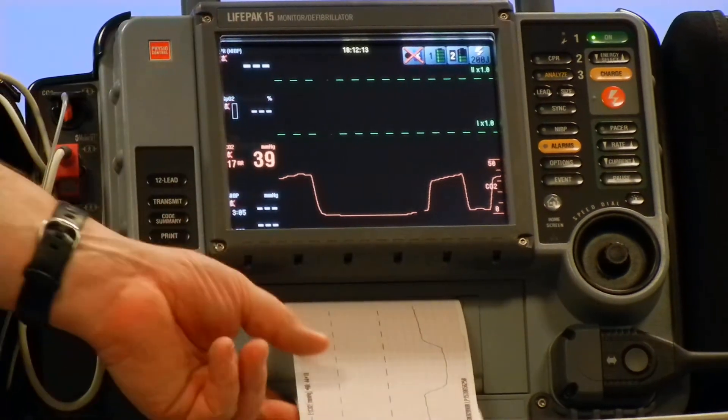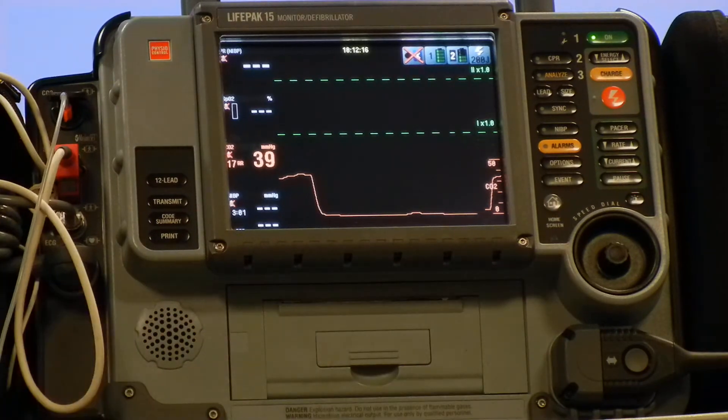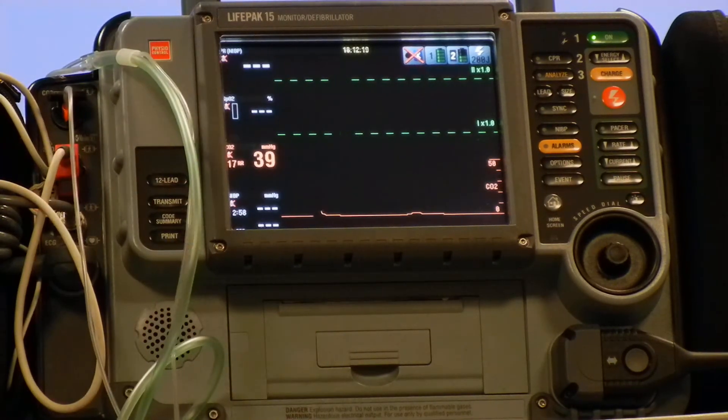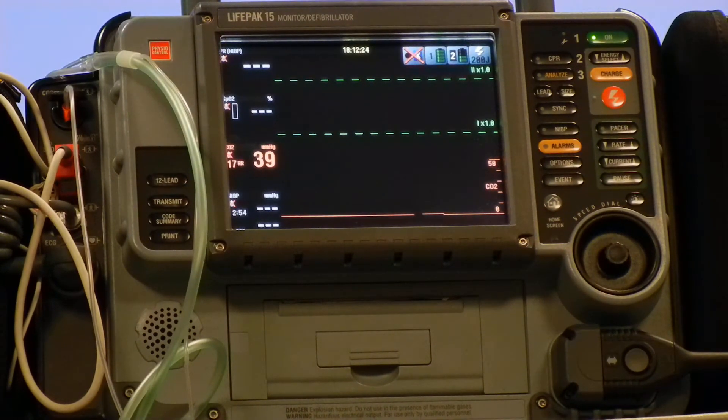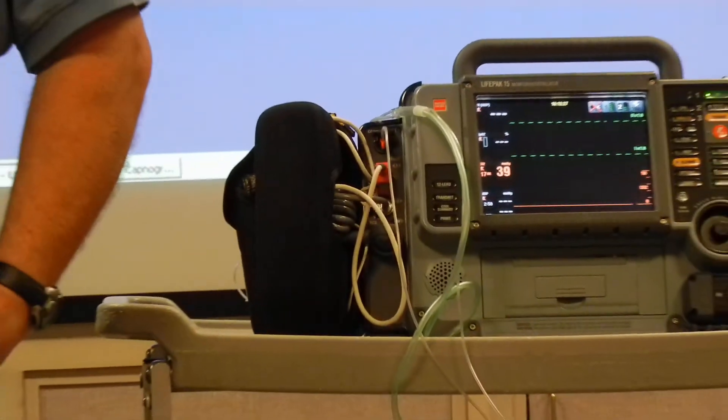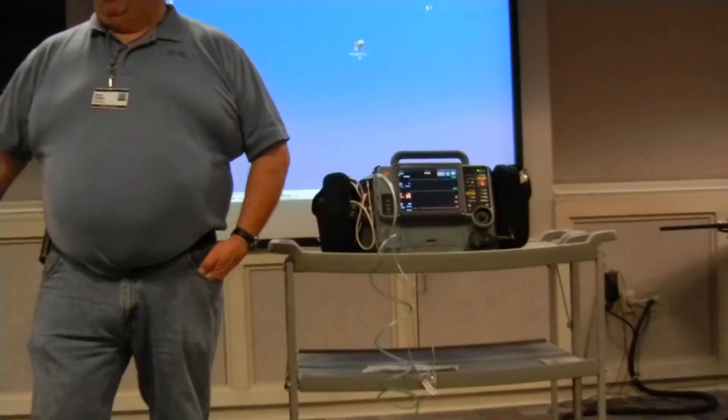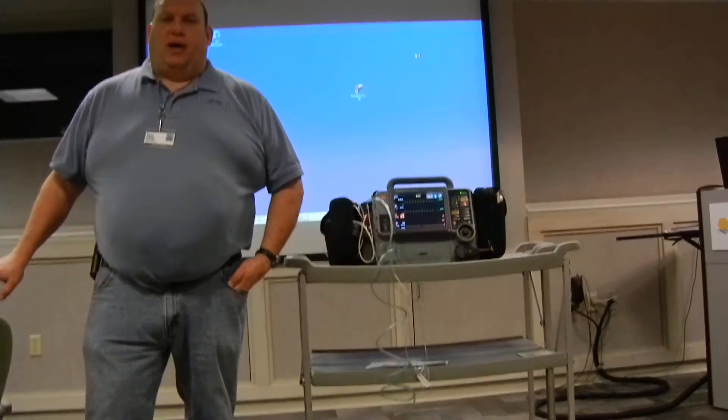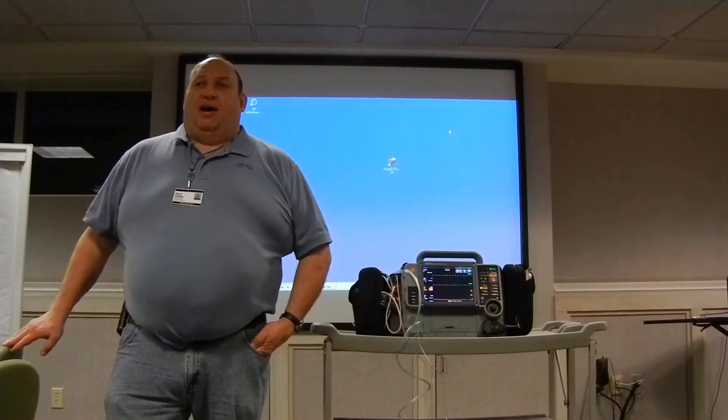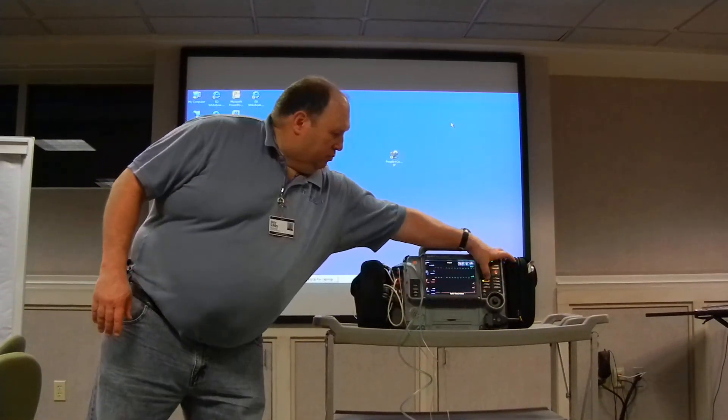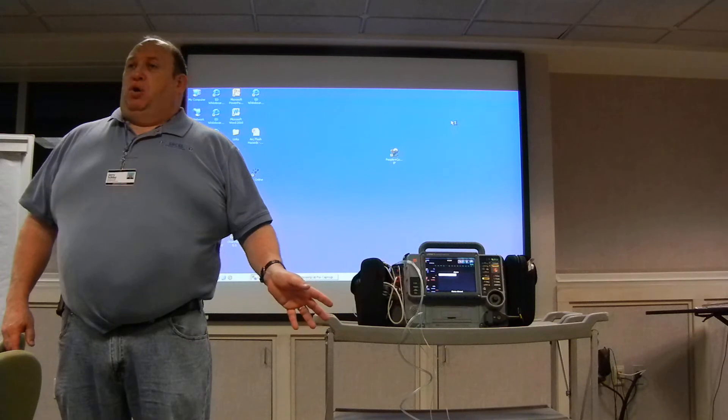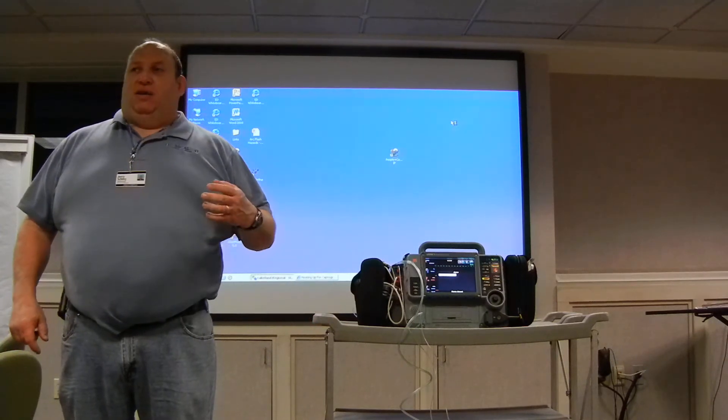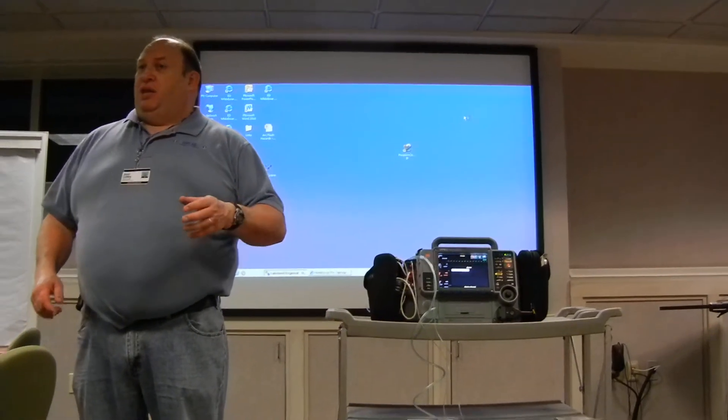Capnography is now the standard for all surgical moderate sedation cases. We use it as a standard in the field to measure whether we have correct ET tube placement. We were using the colorimetric units which you'll see when you go around to the stations, but with waveform capnography, the waveform will only show up if I'm actually in the lungs.